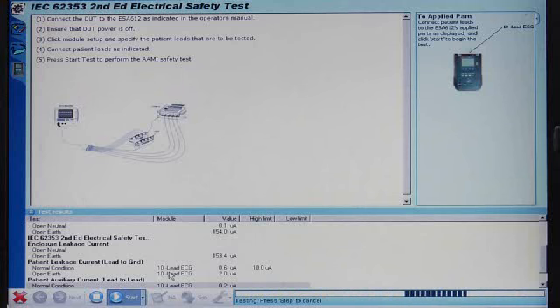The advantage of using automated testing is that the person performing the testing, whether more or less skilled, will follow the same exact test procedure exactly the same way, all tests being performed in a uniform and standardized fashion.